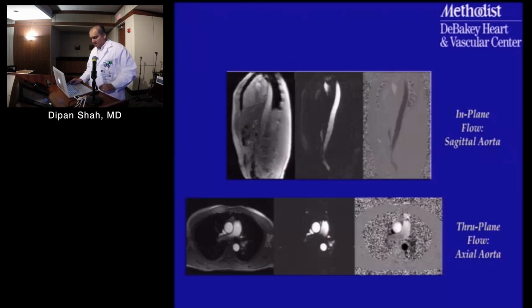Yeah, so basically, I'll have some material at the very end, which is just that there can be some offset errors that can occur. Those are oftentimes due to the scanner itself. And so there's two ways you can try to calibrate that. One of the methodologies is to place a stationary phantom in there, at this exact same location where I'm imaging my aorta, after I take the patient off, and ask what velocity the scanner is measuring at this location. It should be 0 because you know it's stationary. So if it's measuring some velocity, then you know there's a little bit of an offset error.